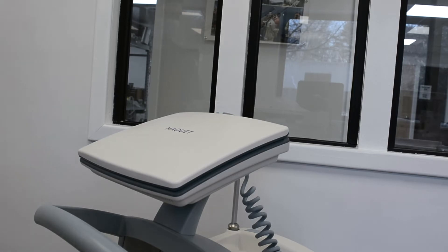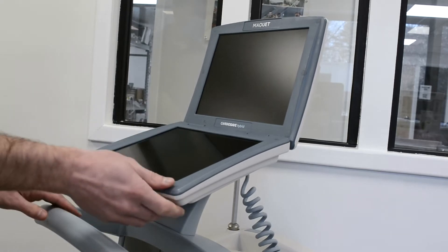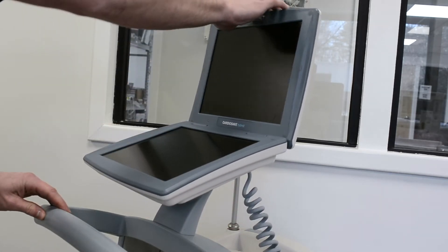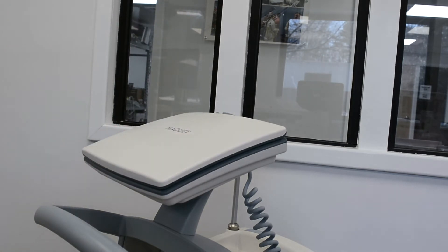The Maquet Cardiosave Hybrid is an intra-aortic balloon pump that can be used in both the transport configuration as well as the hospital configuration. The Cardiosave Hybrid offers an improved user interface compared to the earlier models, like the Datascope CS300.